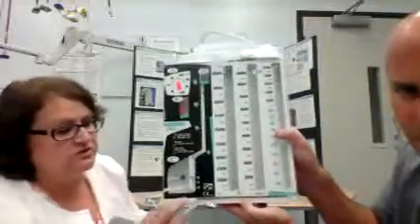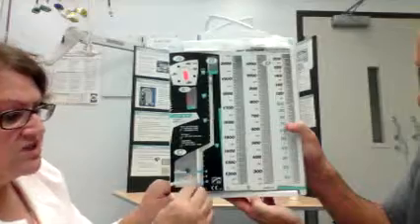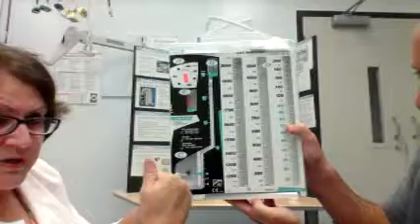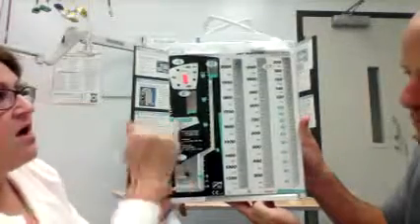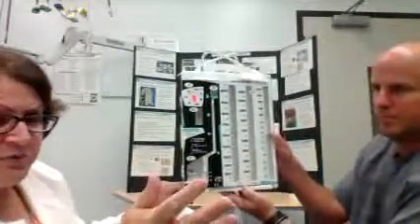Another problem with troubleshooting, you might see that there's an air leak down here where the water goes up to 2 centimeters, right here to the 2 centimeter line. You're going to see a slight bubble occasionally. That's just going to show you that the system's working correctly. But if you start seeing a progressive bubbling that's continuous and it looks pretty hard, then there's something wrong, and it may mean that there's an air leak. So you need to check all of your tubing and make sure that you're not having any problems. One or two bubbles is okay, but a consistent vibrating bubble is not okay.